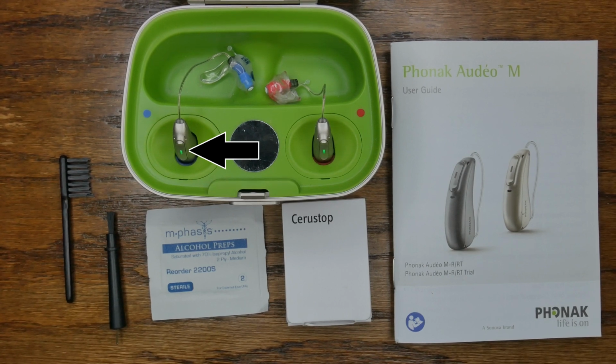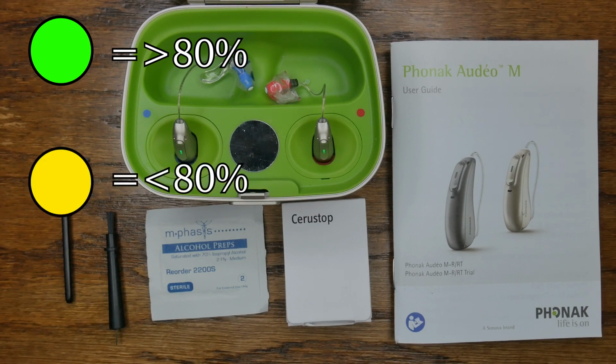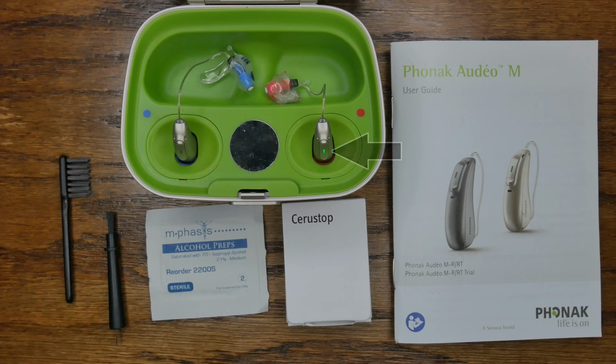The color of the light indicates the amount of charge available. A green flashing light shows that your hearing aid has 80% or better battery charge. A yellow flashing light indicates less than 80% charge, and the flashing red light means that there is less than 20% charge available in your hearing device. When the devices are fully charged, the light will remain on and solid green.